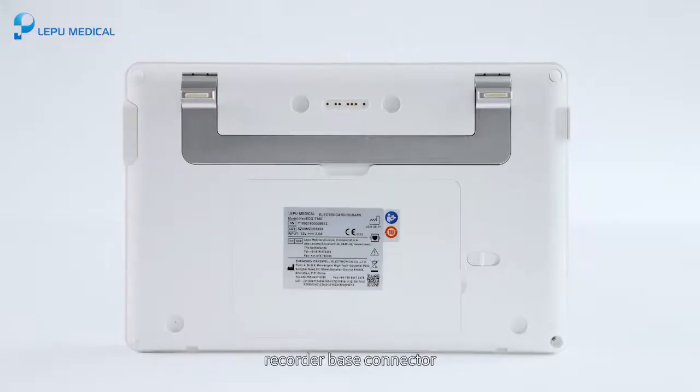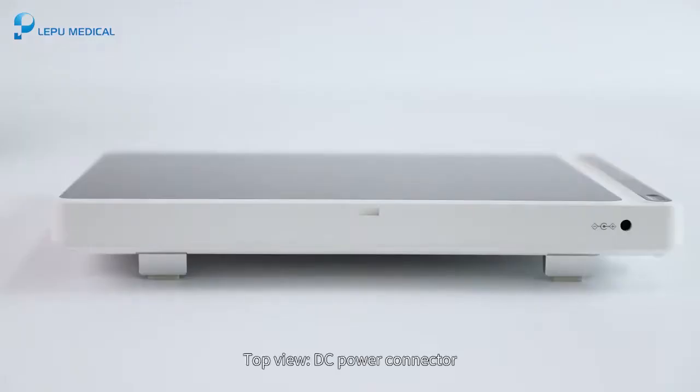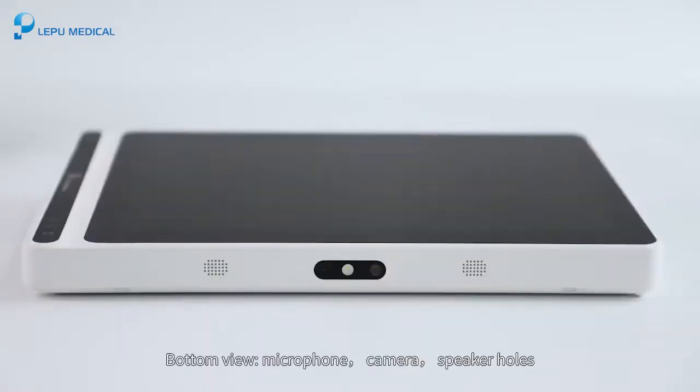Rear view. Recorder base connector. Handle. Battery compartment cover lock. Battery compartment. Top view. DC power connector. Bottom view. Microphone. Camera. Speaker holes.